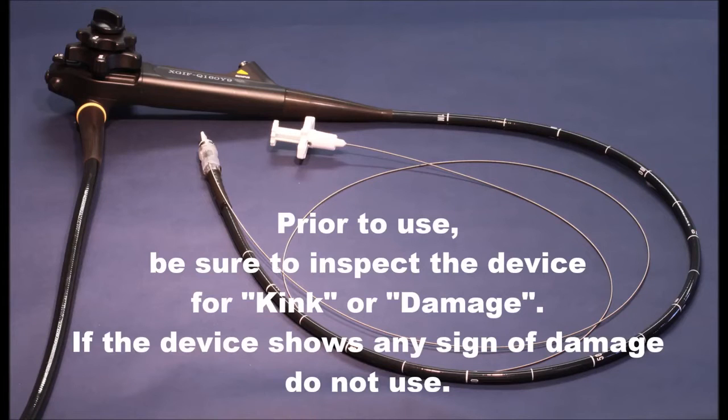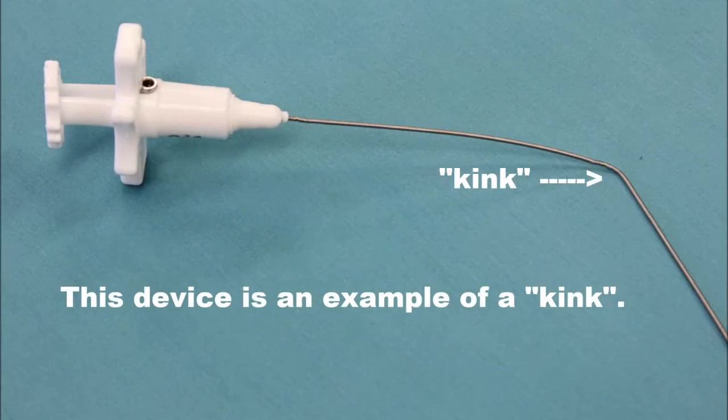Prior to use, be sure to inspect the device for kinks or damage. If the device shows any sign of damage, do not use. This device is an example of a kink.